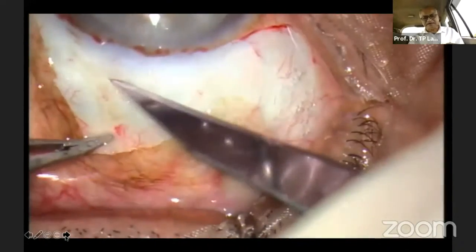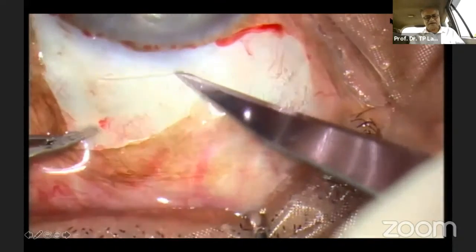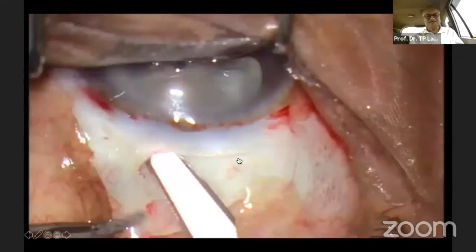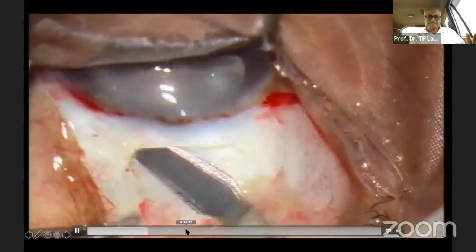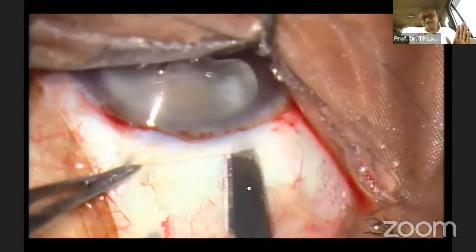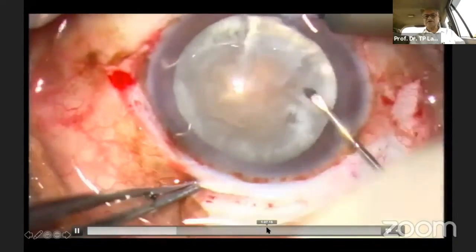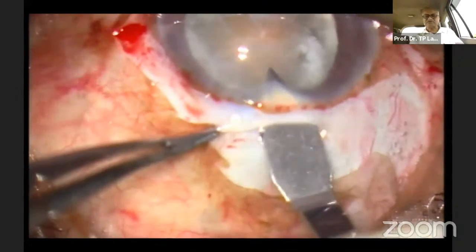Now see, this is the hard cataract, and you can see this is both the cortical and the nuclear cataract together. Now you will see what I am doing is the incision, always in the sclera, where the blackness of the limbus ends, and the pockets. A very integral part of the surgery is a pocket, and I am making the pocket. You will see here the rhexis. Now it is not a must that rhexis should be done, but nowadays I do the rhexis.